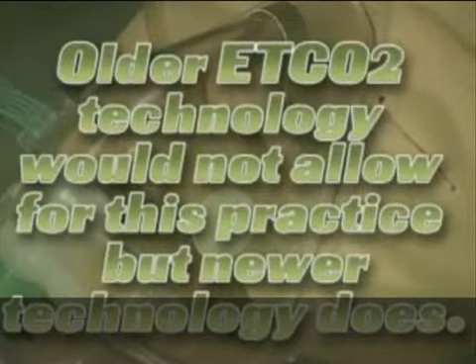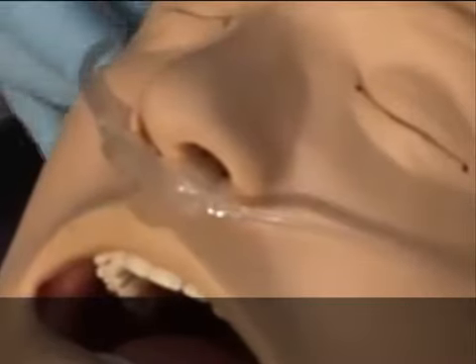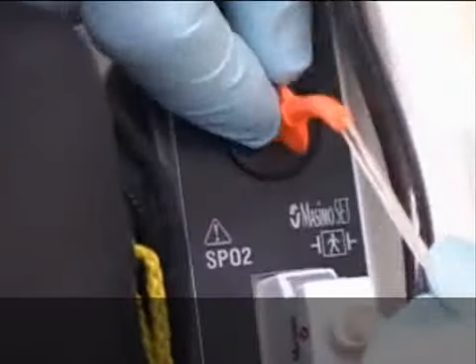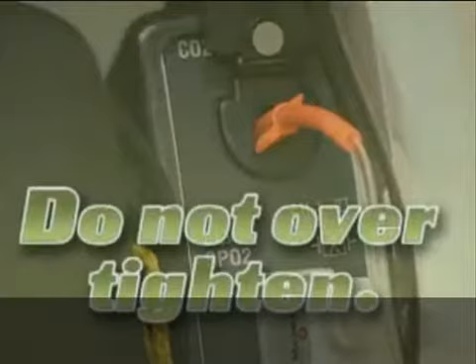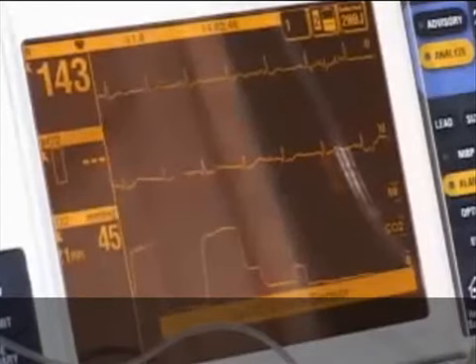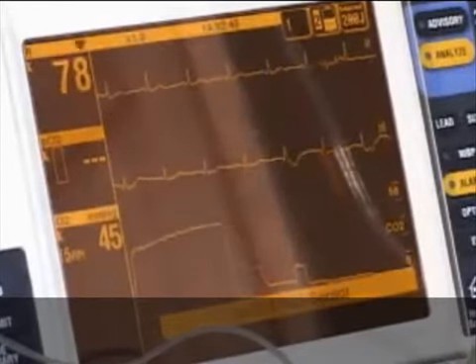To use a nasal filter line, remove it from its package and place it on the patient. Attach the orange fitting at the distal end of the tube and insert it into the port located on the LifePak 12. Secure the fitting by turning it clockwise until snug, but do not over-tighten. You will now be able to monitor the patient's end-tidal CO2 waveform and obtain a carbon dioxide reading.